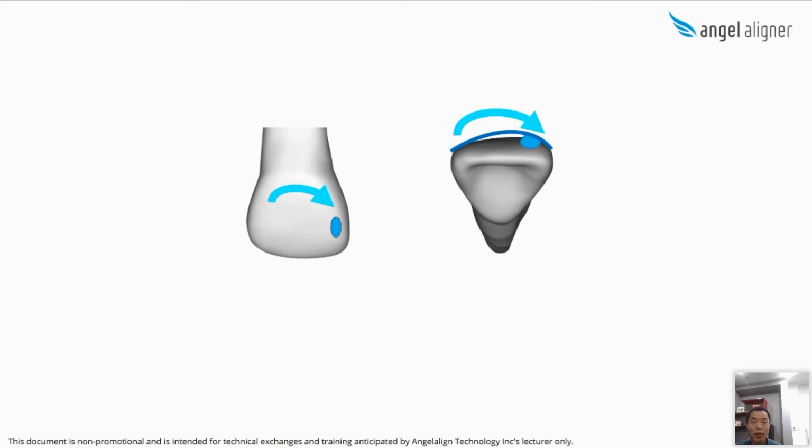This technique is very effective to achieve the last few degrees of rotation, and helps reduce minor rotation, and also can reduce the number of refinements and shorten the whole treatment time.